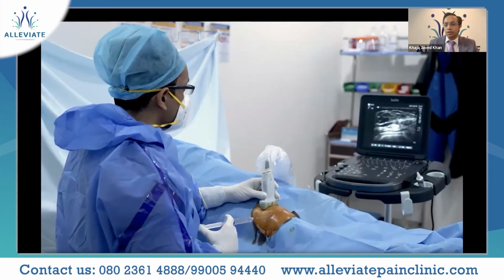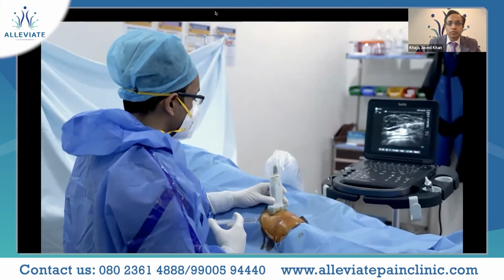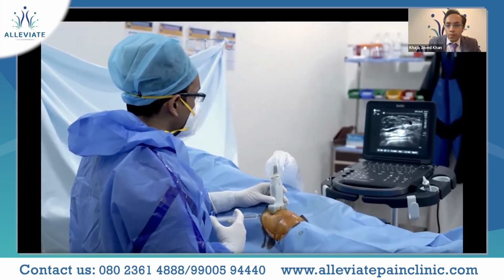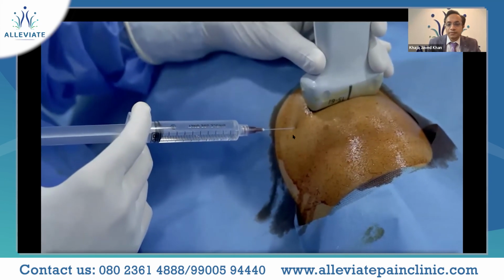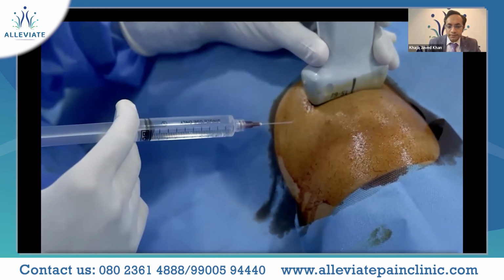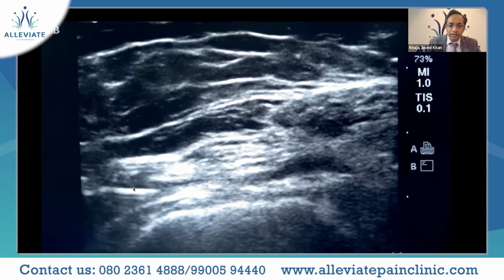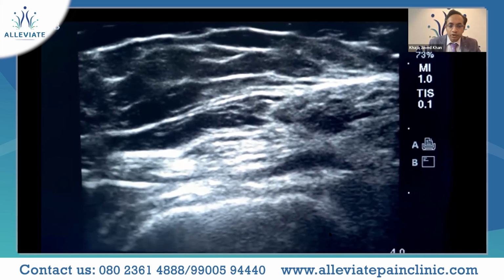We can see this black line over here. Let me just annotate this a bit. Yeah. So here first we are giving in local anesthetic to the knee. And you can see the needle over here. This is the suprapatellar recess, right? And we have the needle which is going in and reaching the target point.